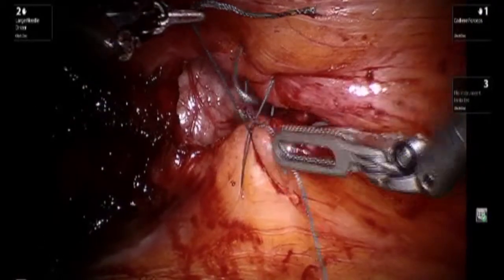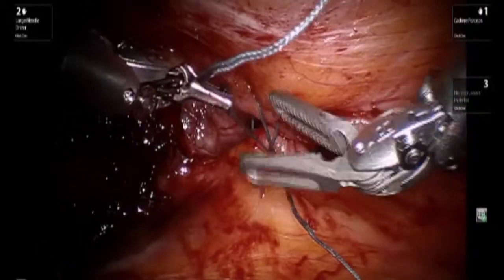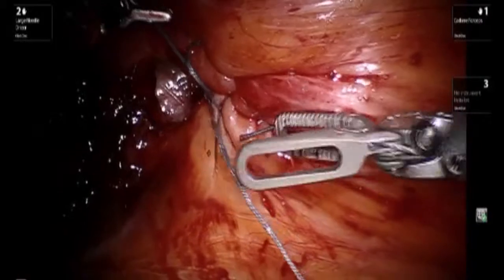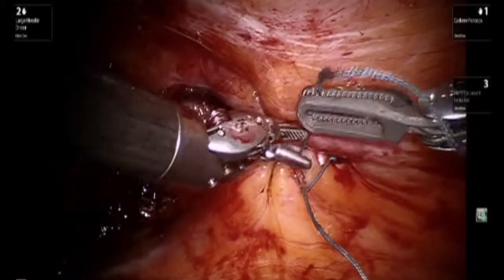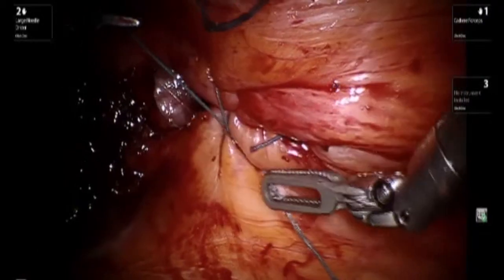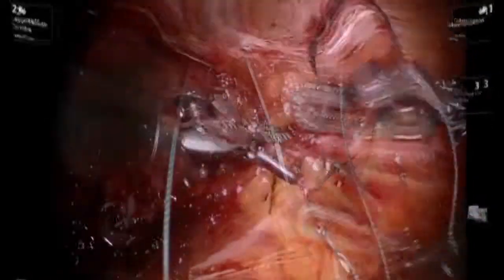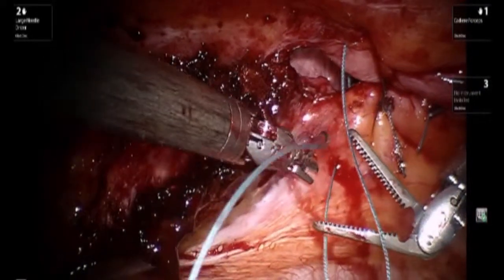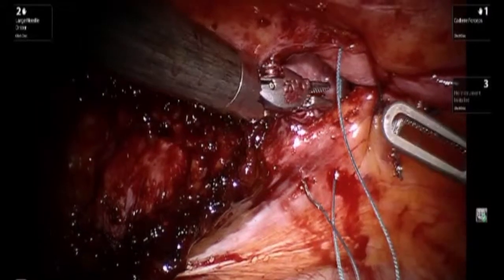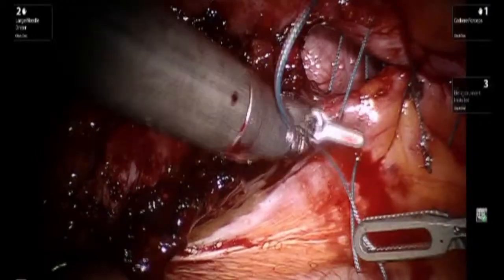You can see how progressively the two fascial edges are brought together, keeping in mind that the intra-abdominal pressure has purposely been decreased for this portion of the case. This is the last figure-of-eight stitch, and afterwards the fascial defect will be completely closed from the intra-abdominal perspective.